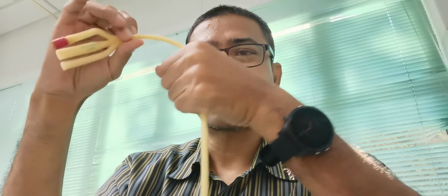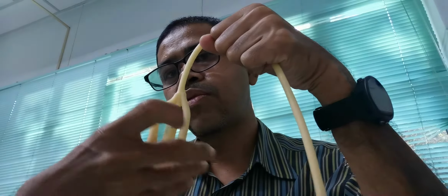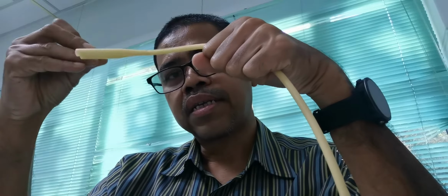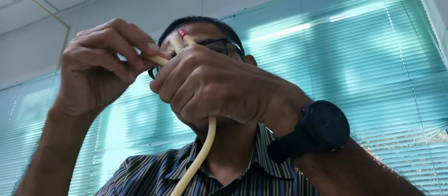Okay, when you insert it, there shouldn't be any resistance. It should go all the way. Okay, let's say you insert until this end, and then you realize the urine comes out. Don't inflate the water for injection at this stage. You need to push it all the way until the bifurcation.